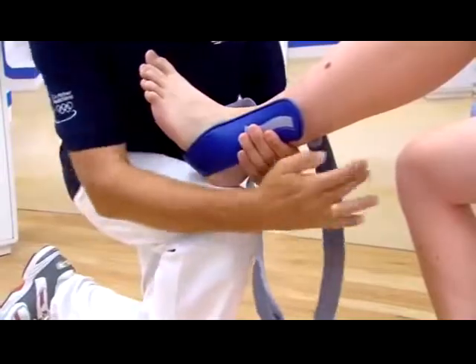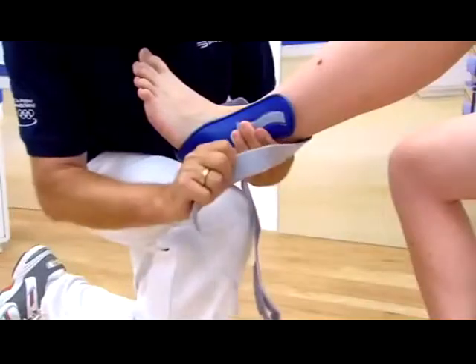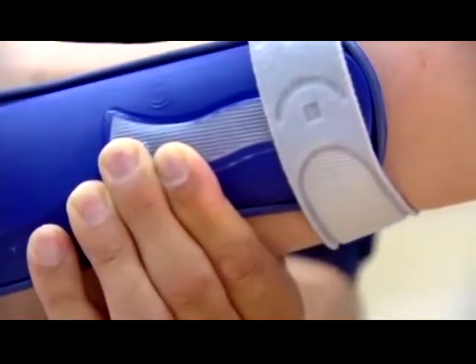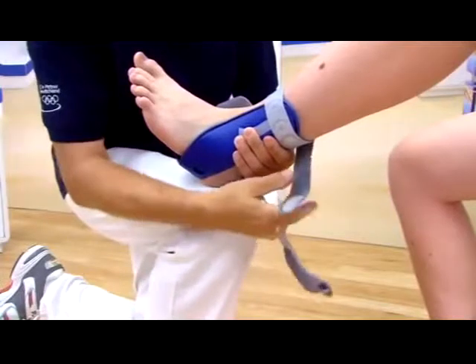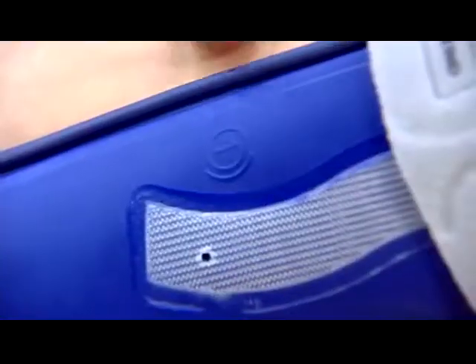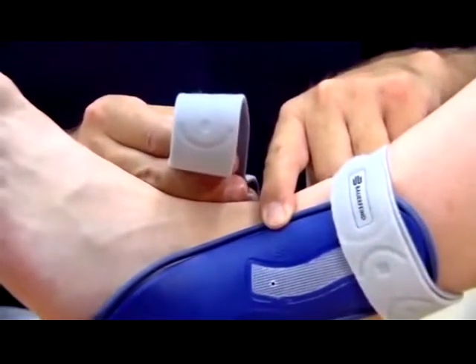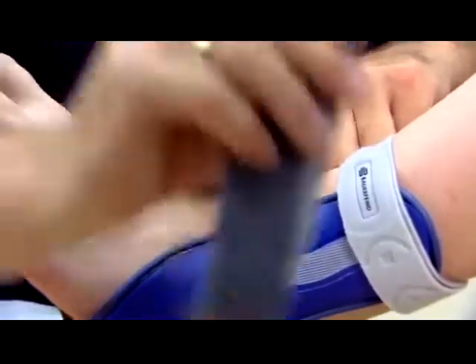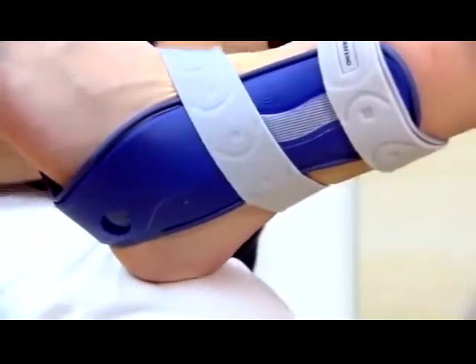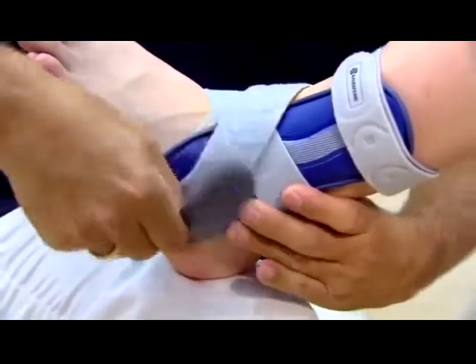The square symbols serve as a guide for closing the upper strap. The upper strap is wound in a circle by pulling it slightly. The round symbols serve as a guide for closing the lower strap. This velcro strap is wound in a figure of eight.